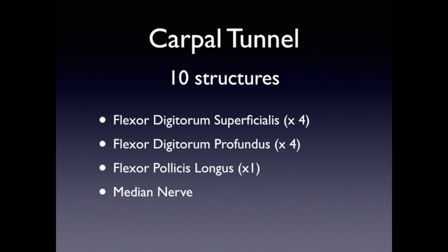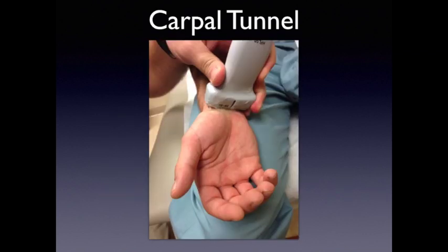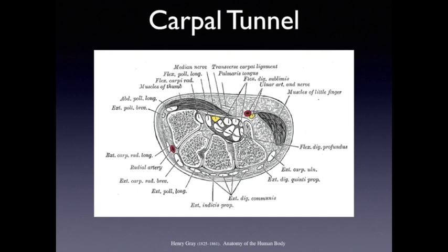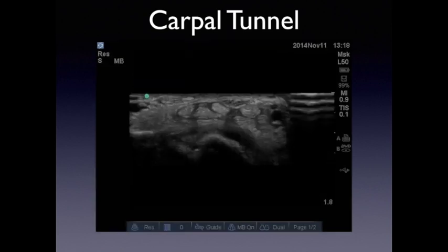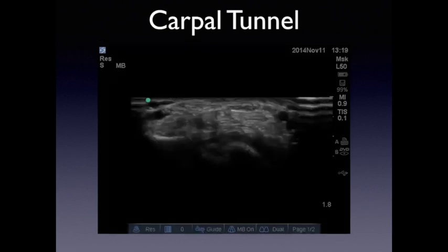The carpal tunnel has ten structures: four tendons of the flexor digitorum superficialis, four of the flexor digitorum profundus, one from the flexor pollicis longus, and the median nerve. You're going to be scanning in the transverse orientation over the wrist. Laterally you can see the radial artery with Doppler flow, and as you move medially you'll see that characteristic honeycomb appearance — that is the median nerve, as all nerves look like that. Then you see the tendons within the carpal tunnel.